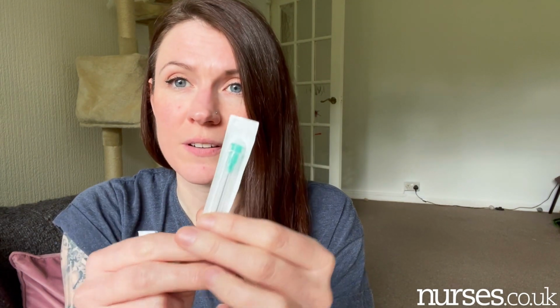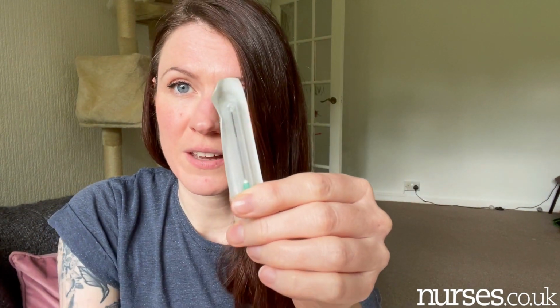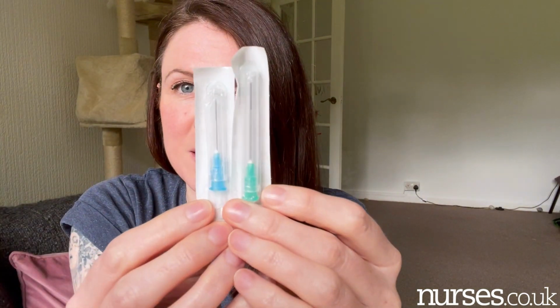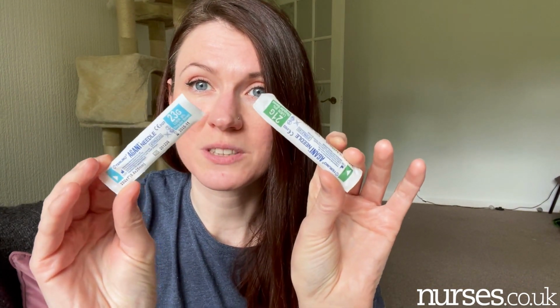The most common needle I use is the blue needle, or this one, which is actually a 23 gauge, which is just the length and thickness of the needle. The higher the number, the smaller and thinner the needle is. So this one that I have, for example, is a 21, and this is a very long and thicker needle than this one. Let me get it the right way around so you can see. That's the difference in needle sizes and colour.